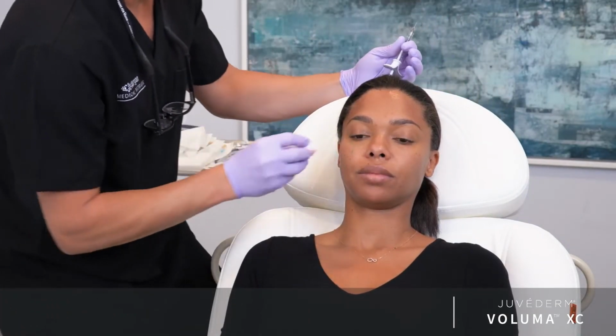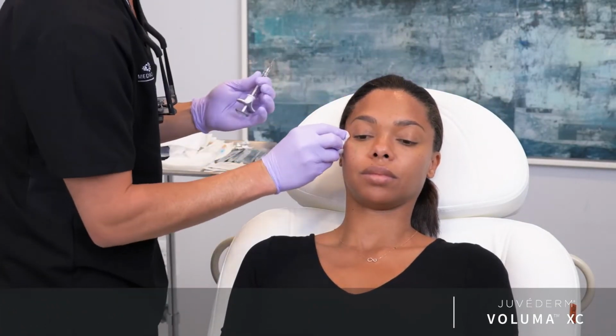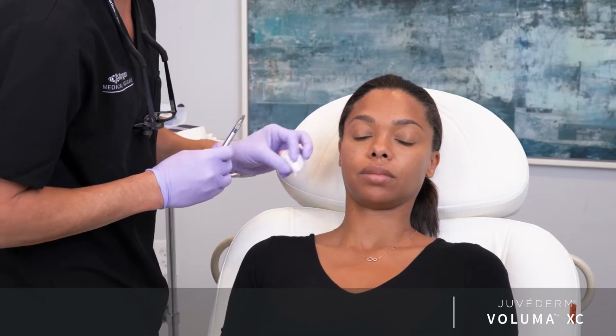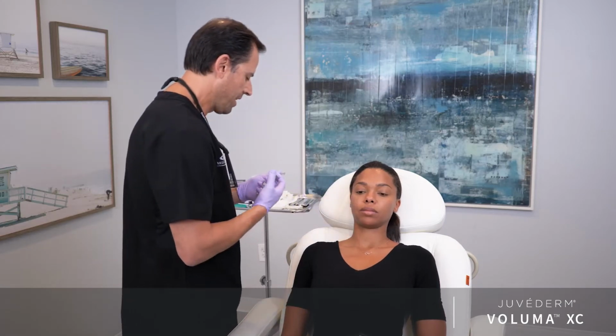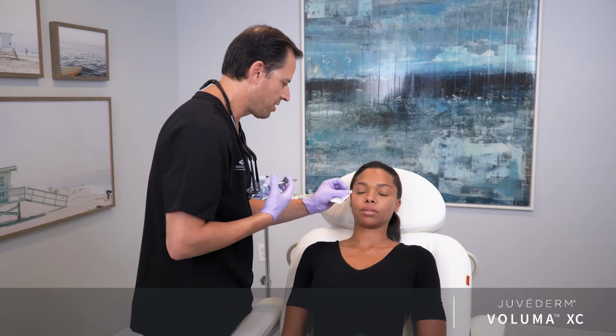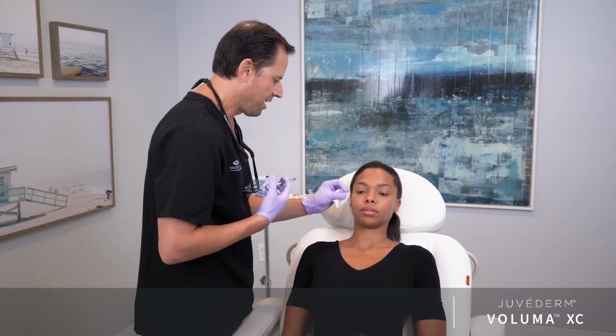So now that we've completed that injection of the zygomaticomalar region on the right side, we'll proceed with injections to the anteromedial cheek on the right side. Now we have an option in the anteromedial cheek of using a blunt cannula or using the given 27 gauge 1/2 inch needle. In Talisha's case, I'm going to use the given 27 gauge 1/2 inch needle and go down to the bone in the anteromedial cheek.